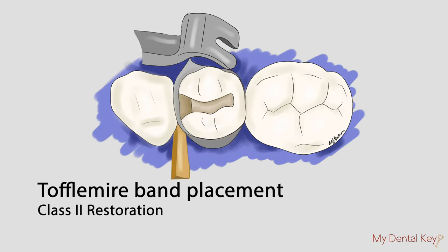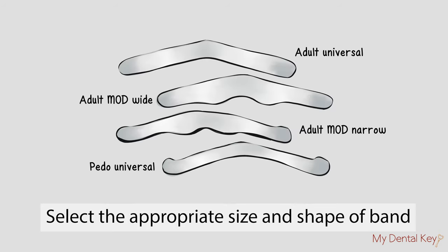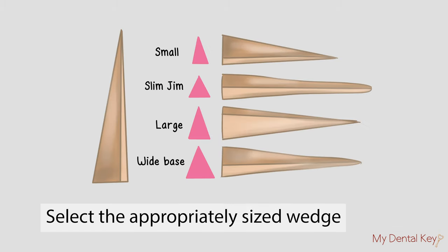In this video, we'll show how to assemble a Toffelmeyer. Assemble the appropriate armamentarium. Select the appropriate size and shape of band, and select an appropriately sized wedge as well.